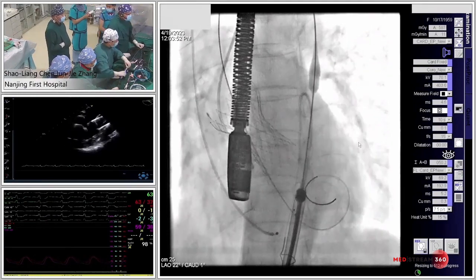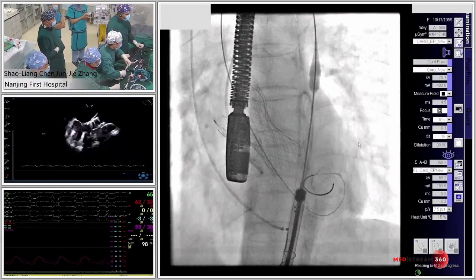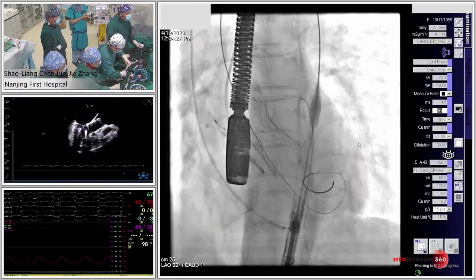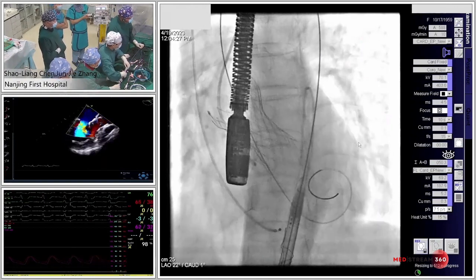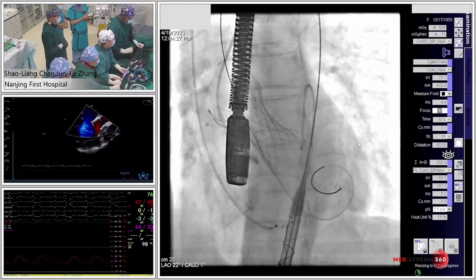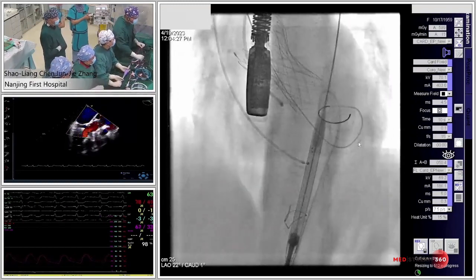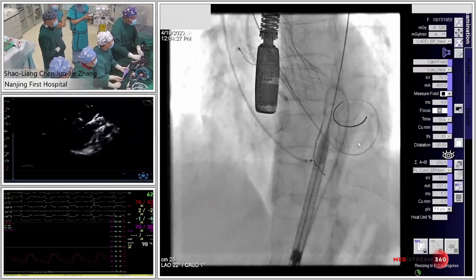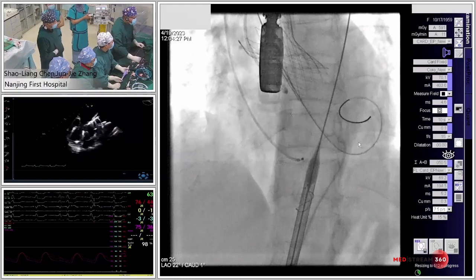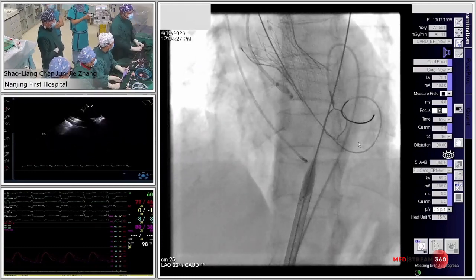So. Hold the wire. Where is it now? Yes, here. Okay. Good.